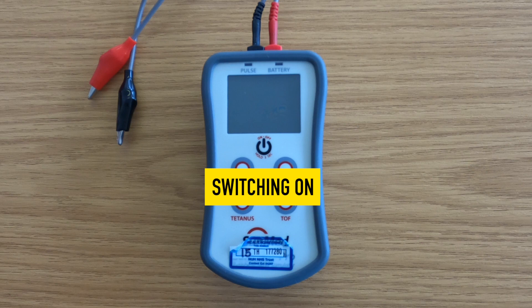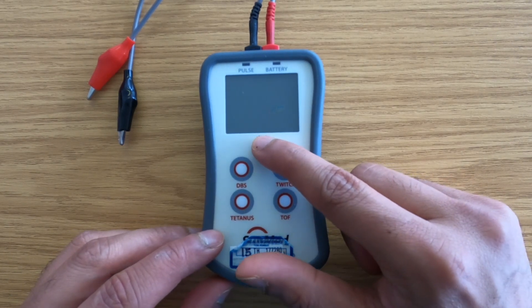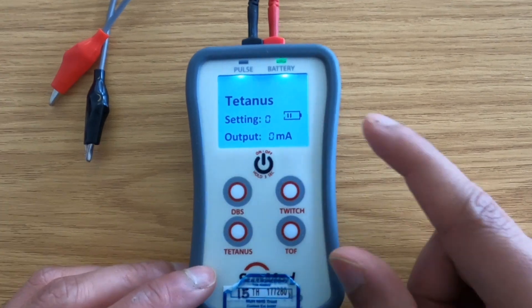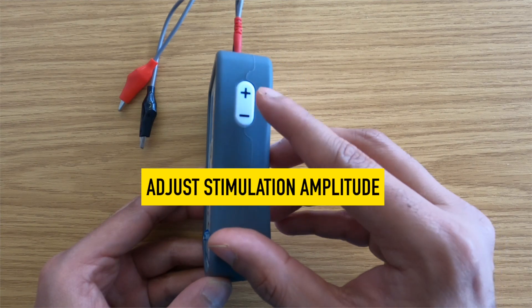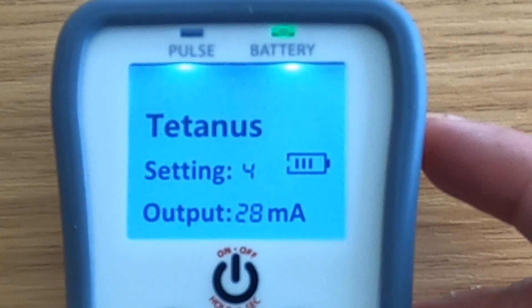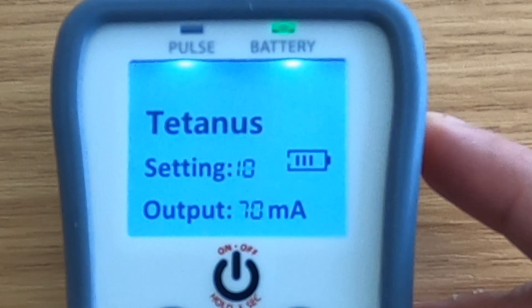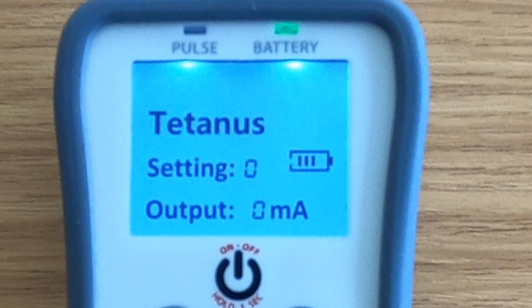The SunStimPro peripheral nerve stimulator is turned on and off by holding this button for three seconds. Once on, the device will be in standby mode and no pulses will be produced. These buttons on the right-hand side of the device are used to adjust the stimulation amplitude of the output current, which may range from 0 to 70 milliamps. If the output current level setting is 0, no stimulation current will be delivered.